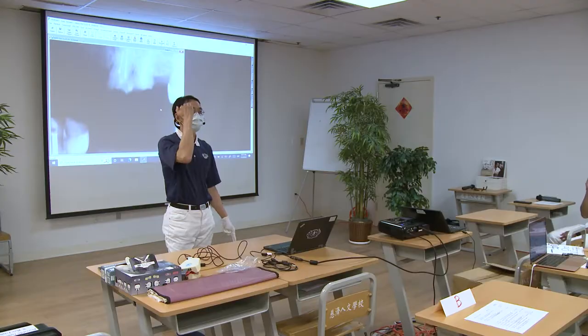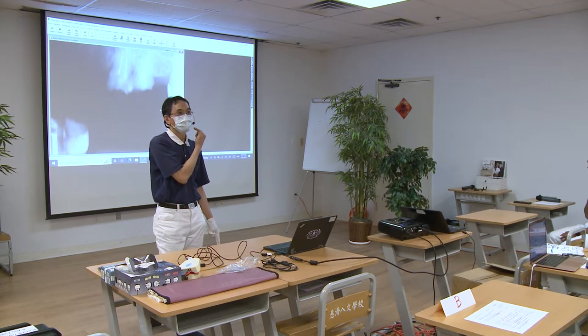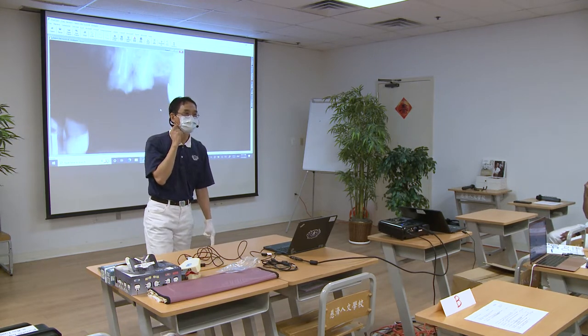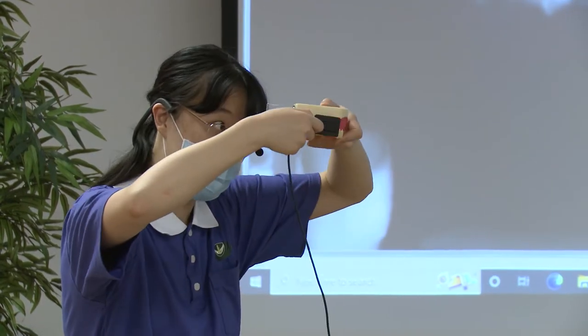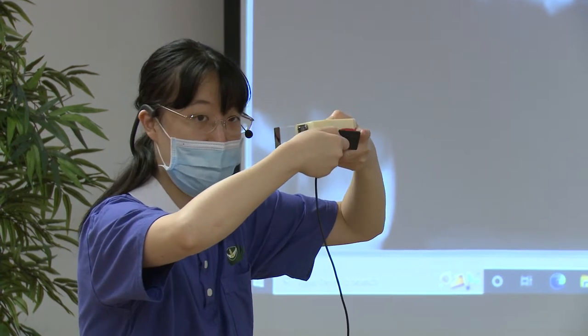And how we are using X-ray to serve all the patients. Top, from the top right to left, is 1 to 16. The bottom, from the left to right, 17 to 32. This one we call the bitewing. You'll only be taking the top of the teeth, and you're also going to be taking a picture of the bone that's holding the teeth in.